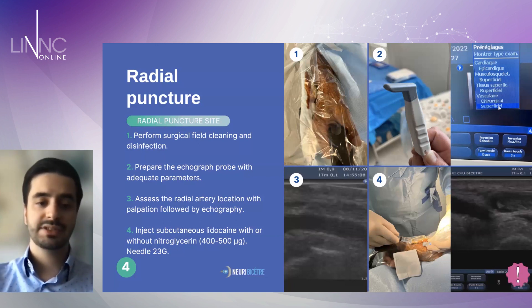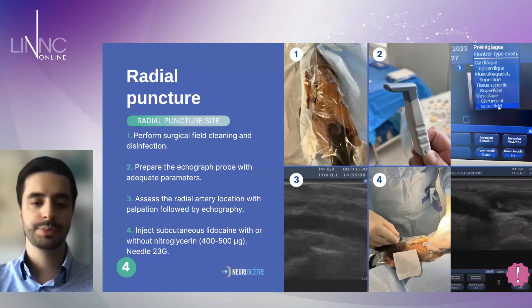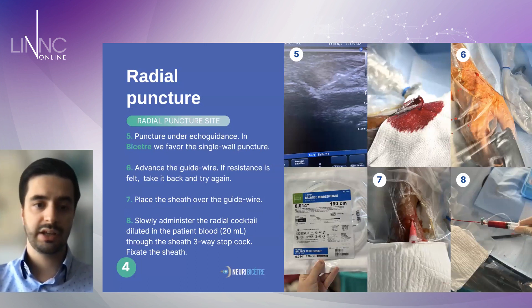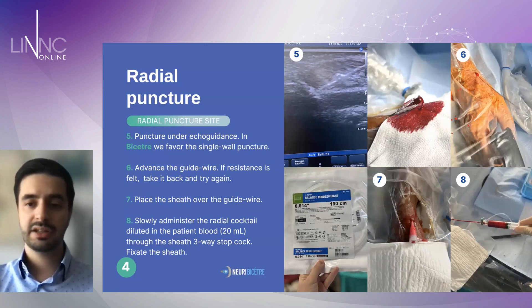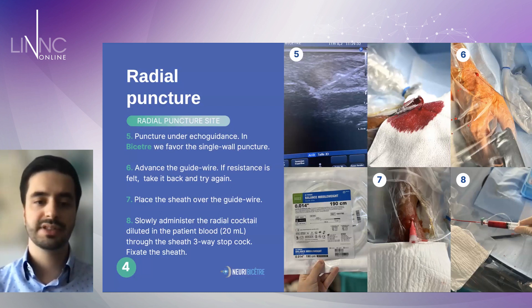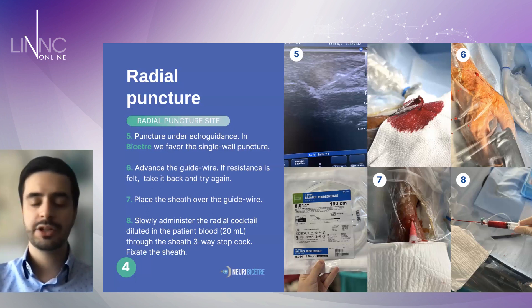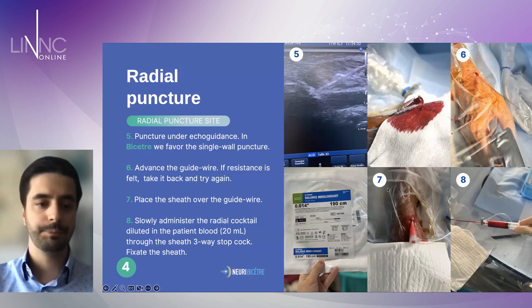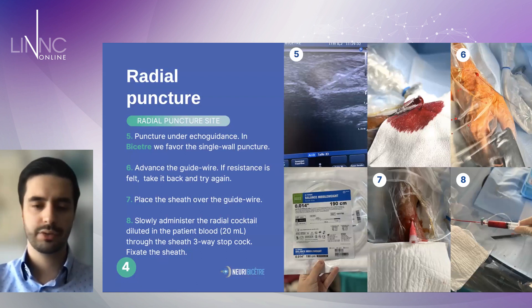After that, you assess the radial artery under echography and palpation, and inject subcutaneous lidocaine with or without nitroglycerin. Puncture is performed under echo-guidance. At Bicêtre, a single wall puncture is normally used to avoid excessive artery trauma. Then you perform the micropuncture with a micropuncture radial-specific system, and place the sheath over the guide wire as you normally would.